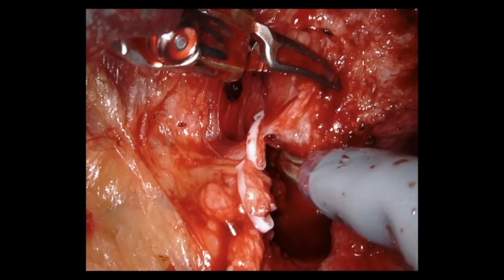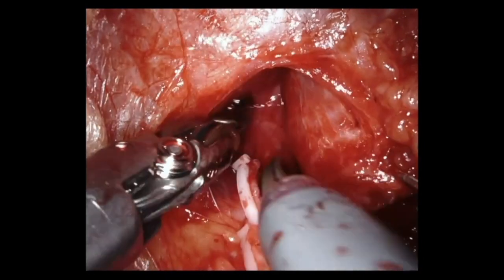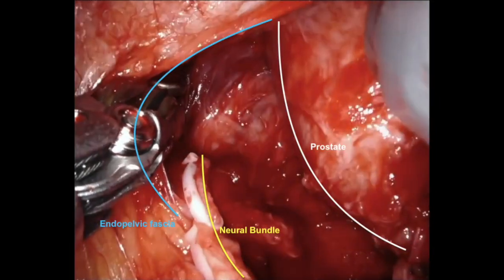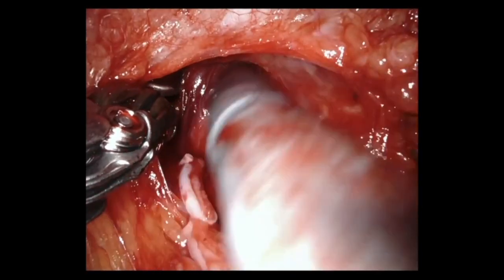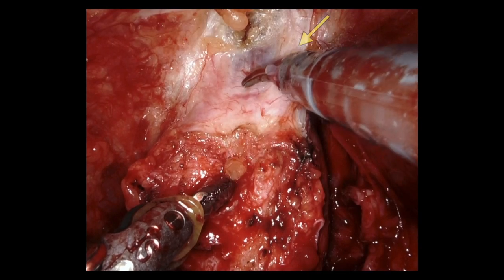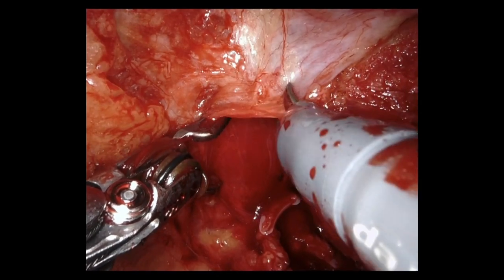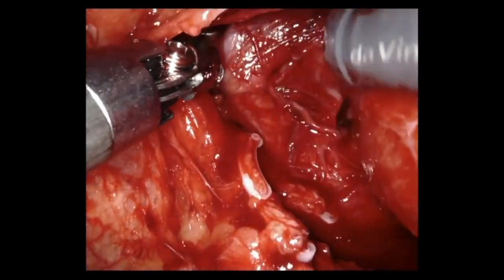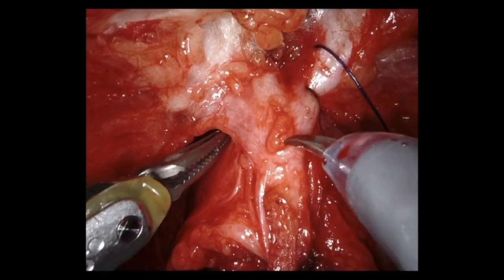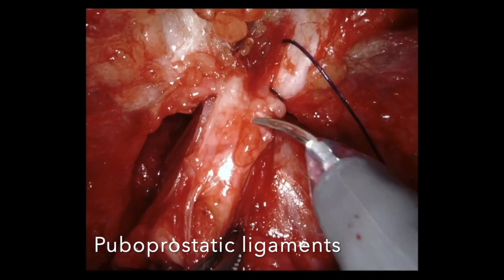After clipping the prostatic pedicles on the left side, the assistant applies traction on the prostate during the lateral and apical dissection. After the prostate dissection, we can visualize the puboprostatic ligaments and the lateral prostatic fascia preservation. The apical dissection in the current technique is performed underneath the puboprostatic ligaments.